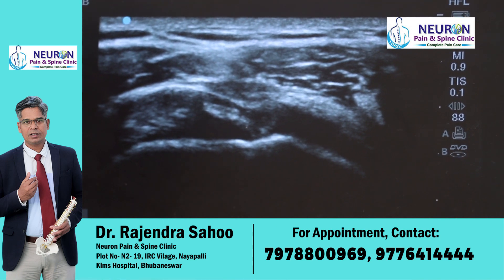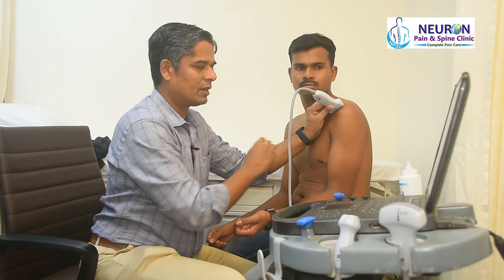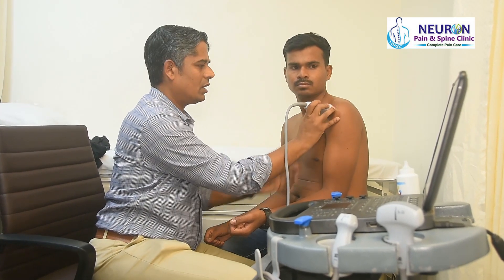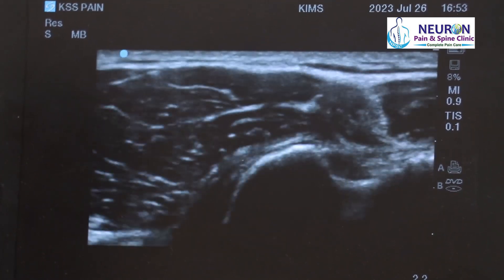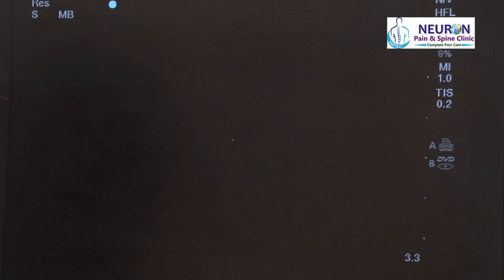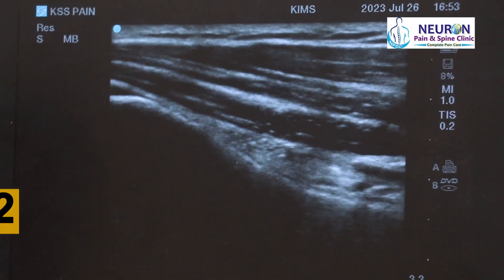Step one is done — you look for the biceps tendon and scan up and down to check for fluid. Now I will change my probe to long axis for step two. In the same position in the long axis, this is the humerus and that is the biceps tendon.